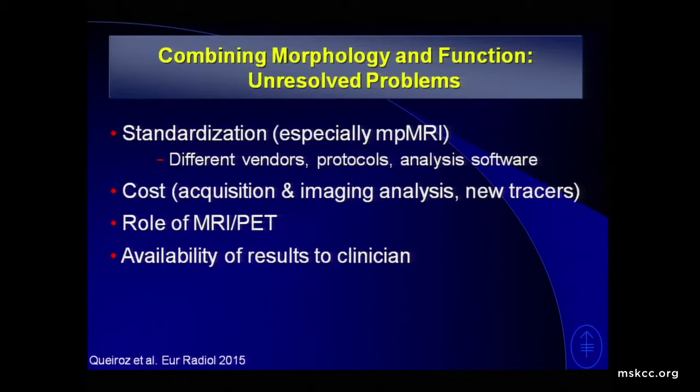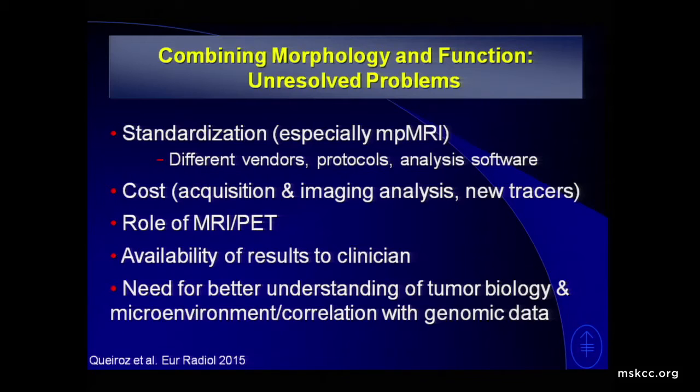And of course, some of these images I showed you are already available to you, but some, more of the volumetric ones, are not, so we have to find a way to press the button on those things and make the results available to you before or as you see the patient.